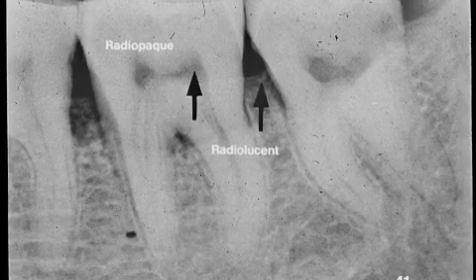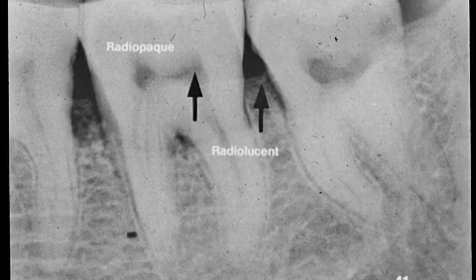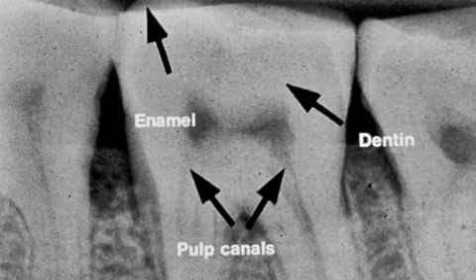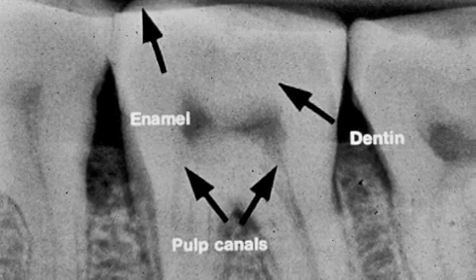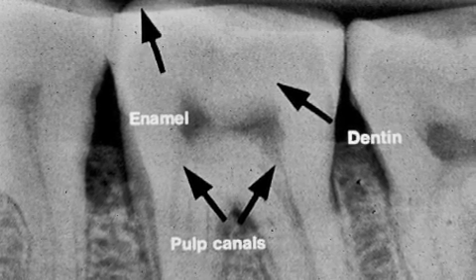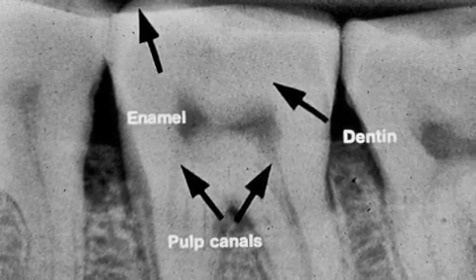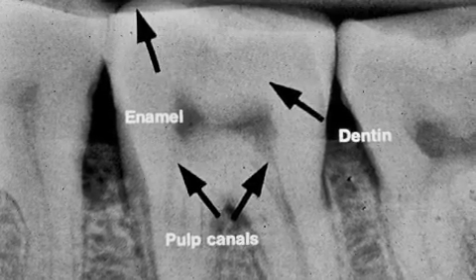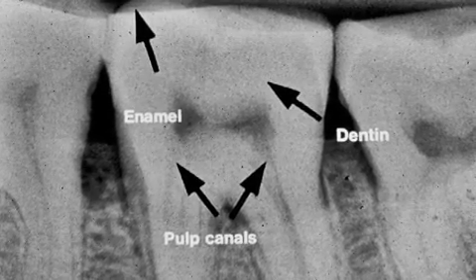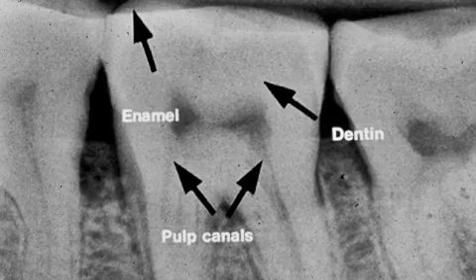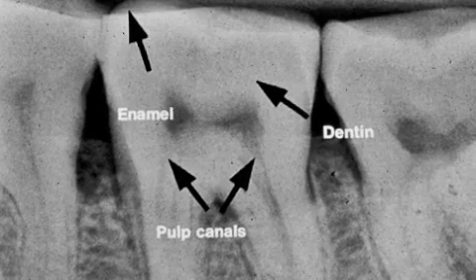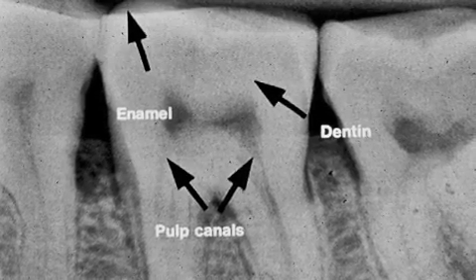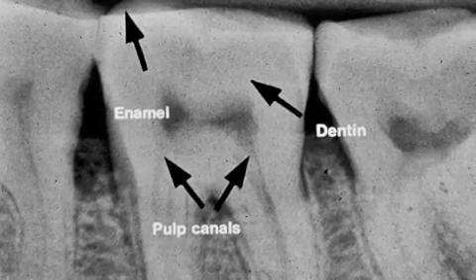The arrow points to the pulp of the tooth, which is radiolucent. The enamel is shown by the uppermost arrow and extends from the dentinoenamel junction to the top part of the tooth. It has varying opacities due to attrition, or wearing down of the enamel. The enamel in this case is in health and is worn.